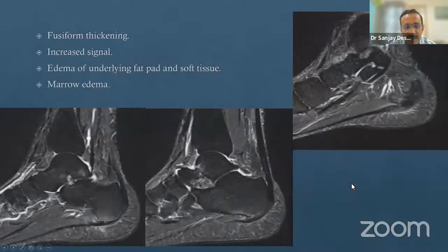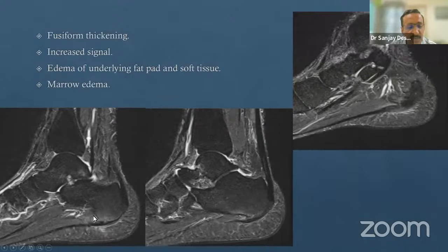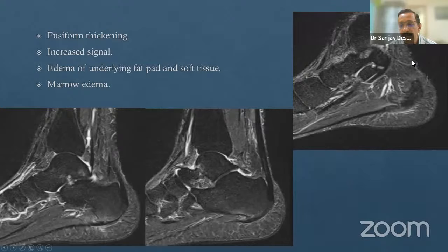On MRI, this is how a normal plantar fascia looks on axial images compared to an abnormal situation. In this patient, you see abnormal thickening of more than four millimeters of the posterior plantar fascia at the calcaneal insertion, edema in the underlying calcaneum, a small spur with marrow edema going anteriorly, and soft tissue thickening surrounding the insertion. All these findings together should be called plantar fasciitis—just thickening or just a spur without marrow edema does not qualify.